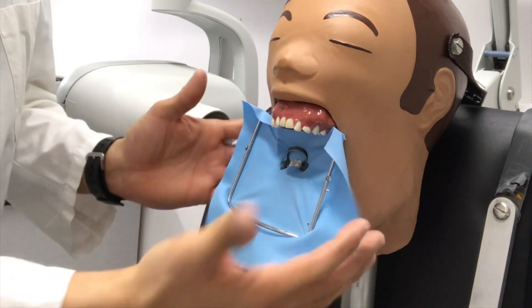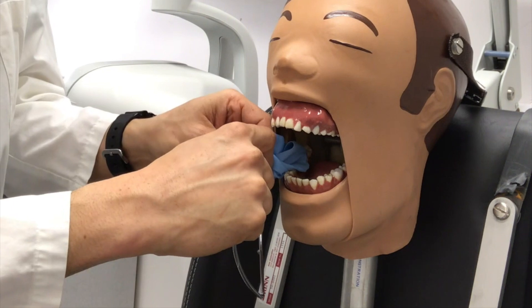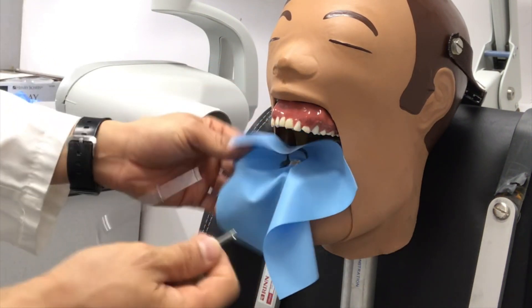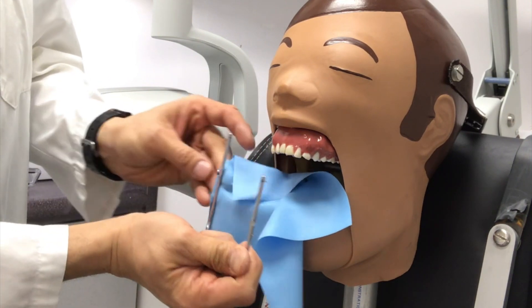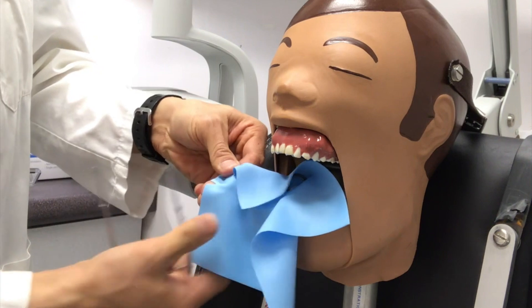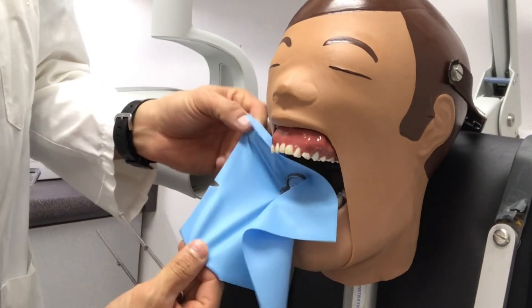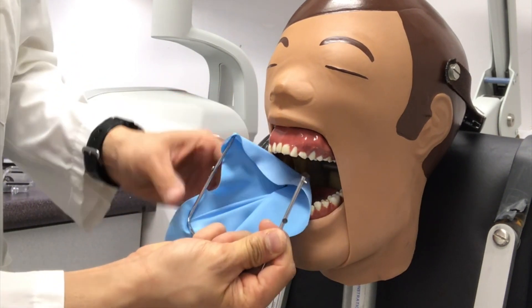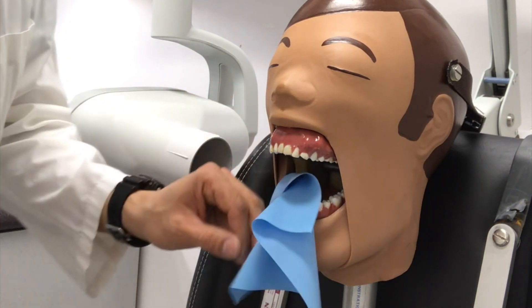One of the problems when you take your rubber dam off is it becomes a googly mess when you go to put it back on. What I do all the time is when I take my rubber dam frame off, I tear a corner off, so I know that every time I go to put the rubber dam frame back on, that corner — that side of the rubber dam — is to my right. Just a little trick that makes it so much more efficient.